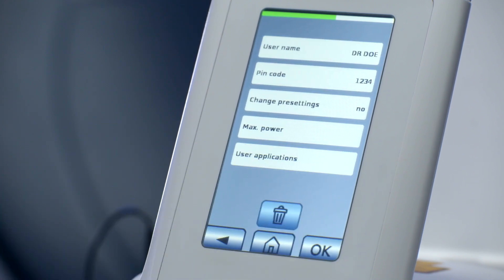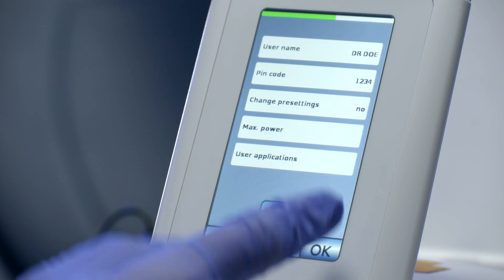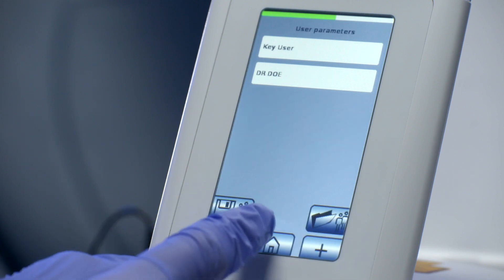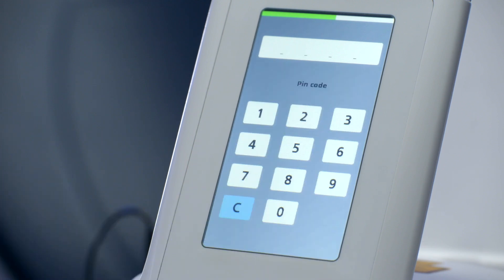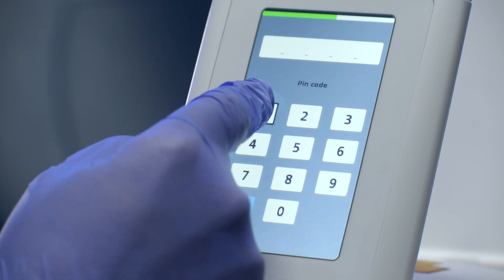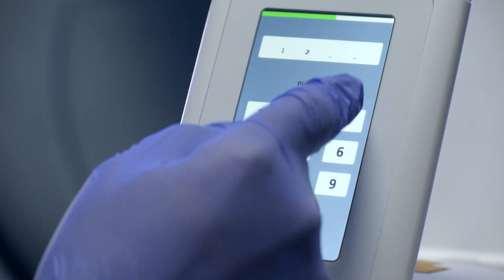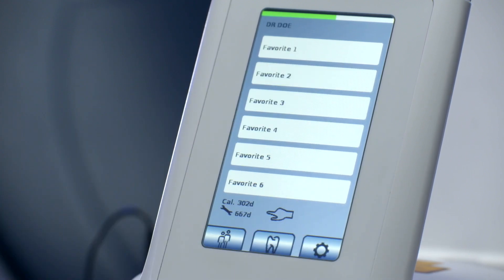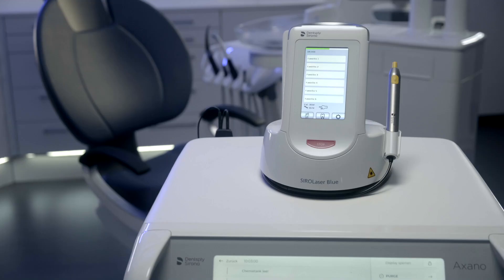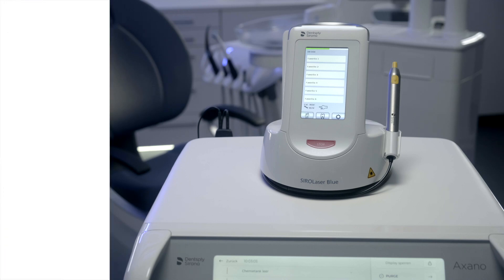Save this new user by pushing the OK button. When you enter the PIN code of the new user, you are also able to individualize the favorites in the home main screen. And now, you are ready to work.